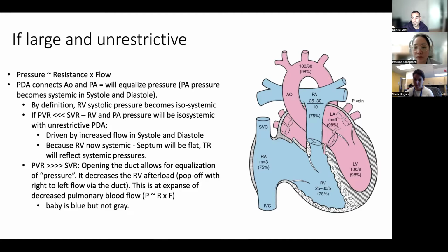So ostial stenosis, for example. It could be because your left atrial pressure is high, or it could be because your LV end-diastolic pressure is high. So then you need to figure out which part is high among all of these. What's difficult by cath is to access the left side of the heart in tiny babies.